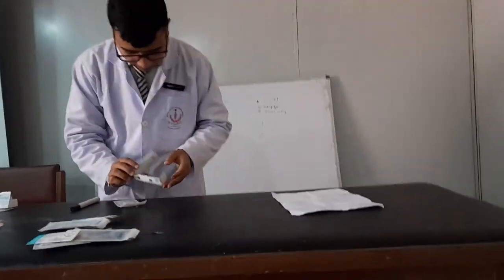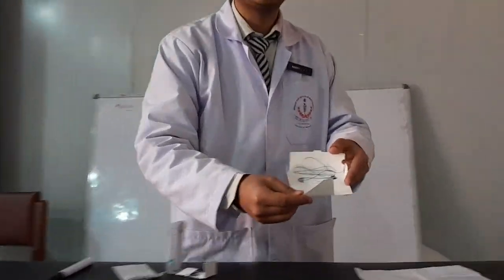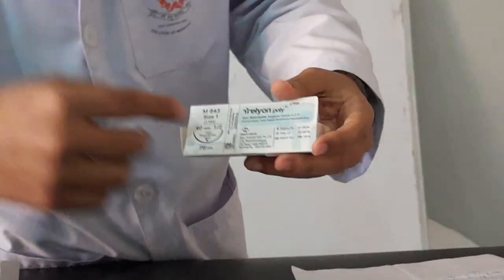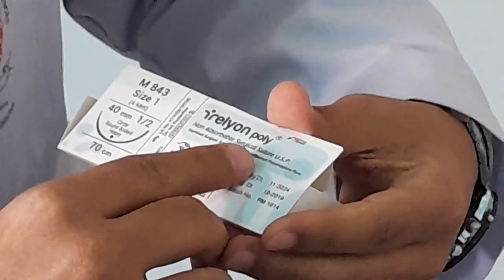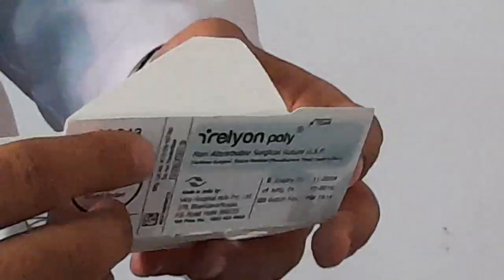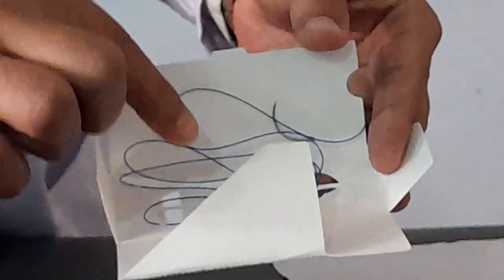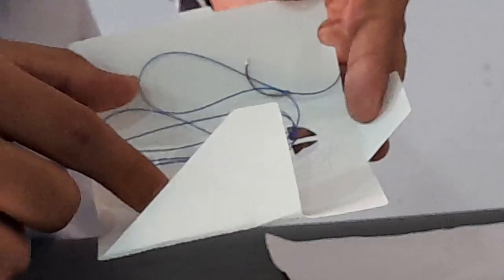And now I will show you here. This is the example of a monofilament suture. You can see the labeling is also given here. It is monofilament polypropylene in blue, so it is the Prolene type of suture. You see here, when you open it up, this is in a pattern. A certain pattern has been maintained here while packaging it.